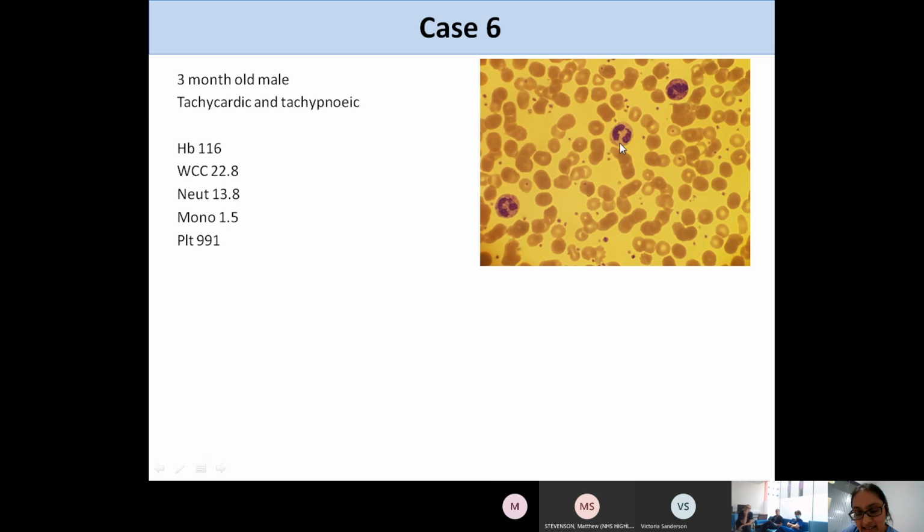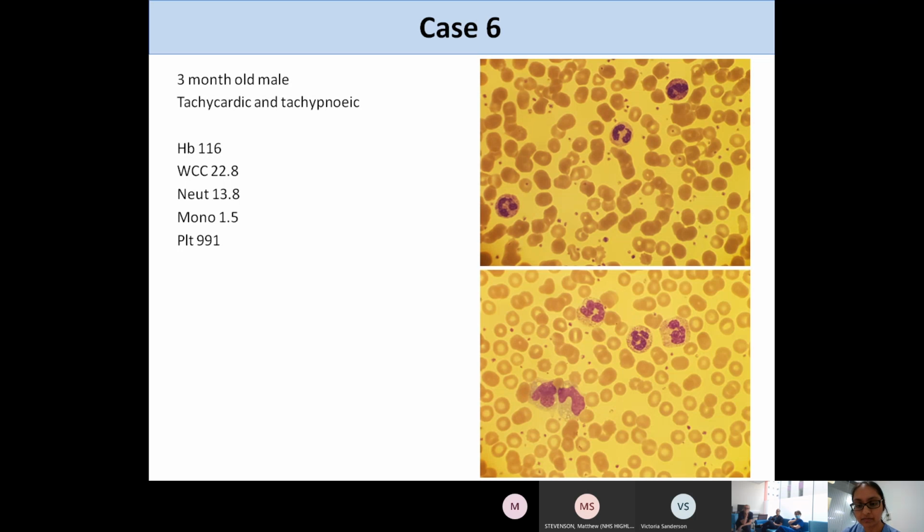This neutrophil has these pinky granules, which you would expect. So does this neutrophil and this neutrophil, but these granules are very dense, and there's a lot of them, and they're quite chunky. And this is what we call overgranulation, and we call this toxic granulation, and this happens in response to infection. Again, we've got a nice example of some very granulated neutrophils here.